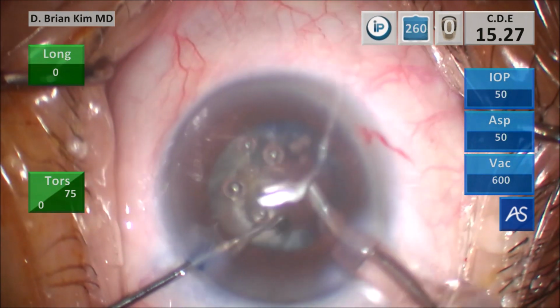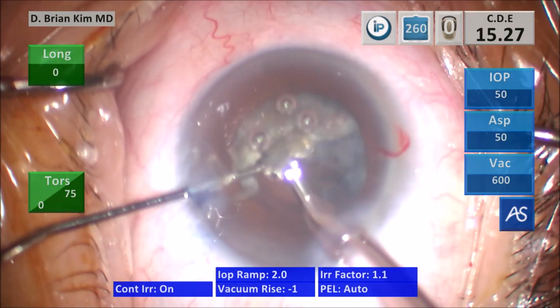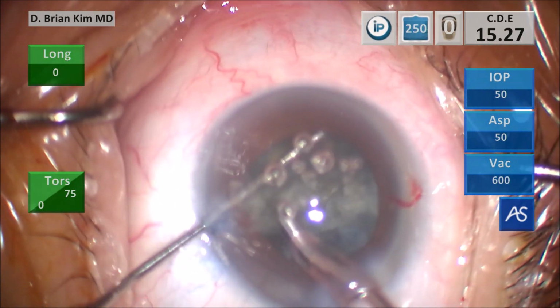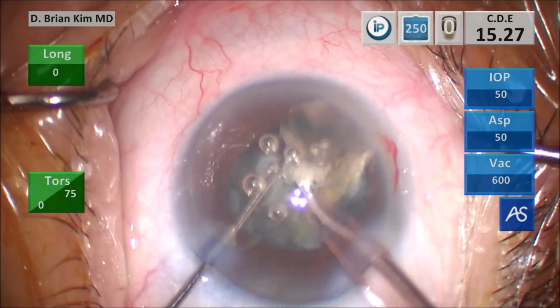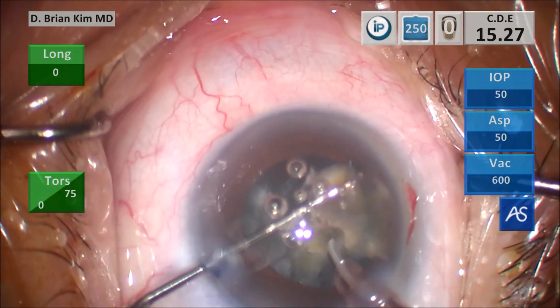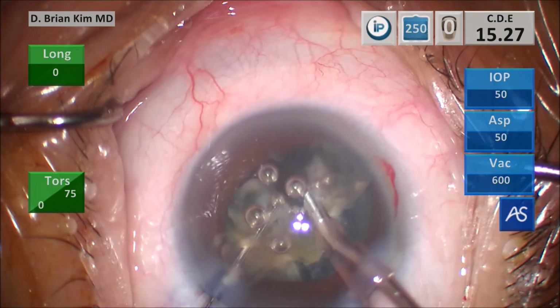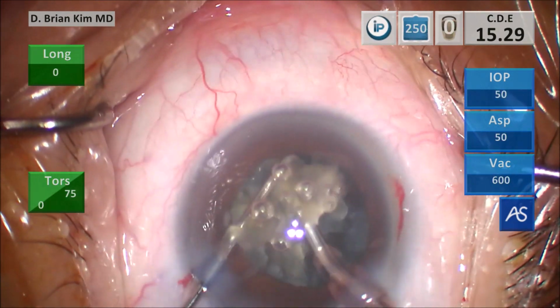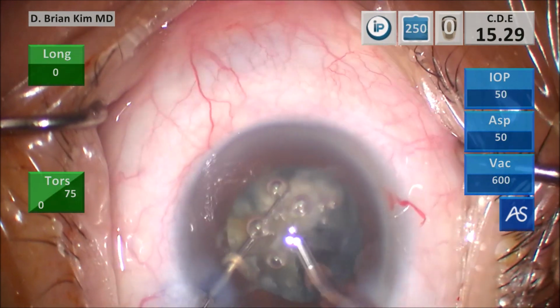Again, you can see those big old bubbles. I'm working much lower below iris plane. And so because of that, I'm away from the cornea, and I'm able to preserve the viscoelastic and the bubbles. So think about it, guys. As I'm executing these techniques and I'm away from the corneal endothelium, that means I'm away from the bubbles and I'm not eating the bubbles. If I'm away from the corneal endothelium and I'm not eating the bubbles, that means I'm not eating the viscoelastic. And that means the endothelium is protected by the dispersive viscoelastic.